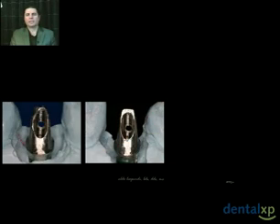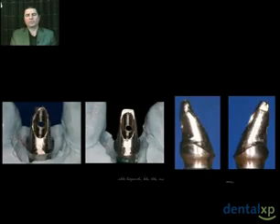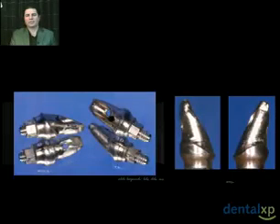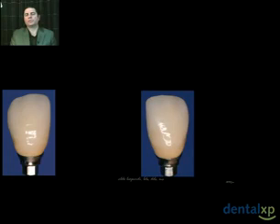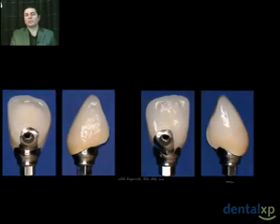These are the abutments on the master cast, post-preparation by my technician. If you look at the lateral view, you can see the rise and fall of the margin in 3 dimensions. Here's a mirror view. And here's a view of the restoration on the abutment, facial, interproximal, and also lingual view.